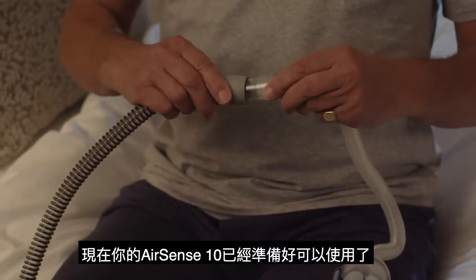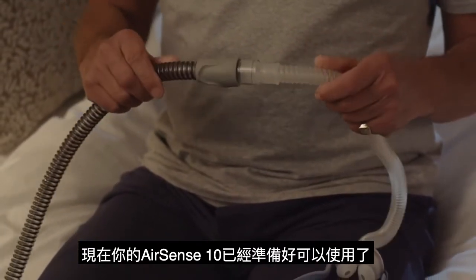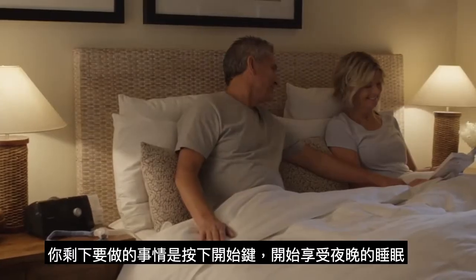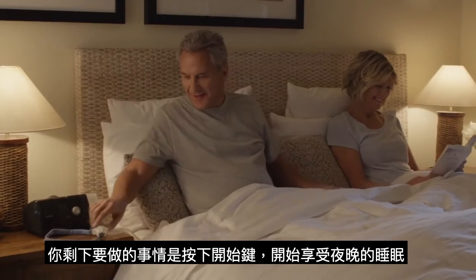Next, attach your mask. Your device is now ready to use. All that's left to do is press Start and enjoy a great night's sleep.